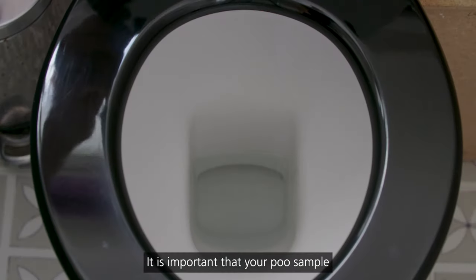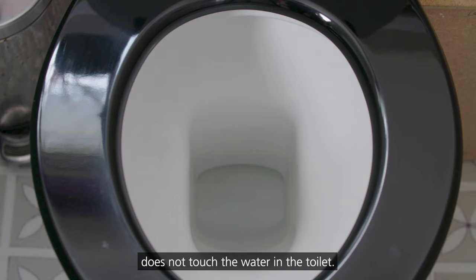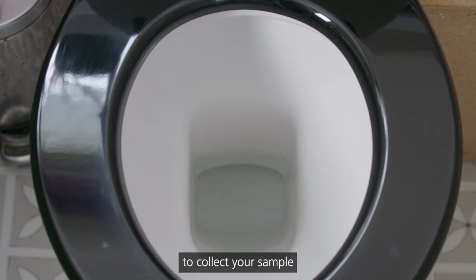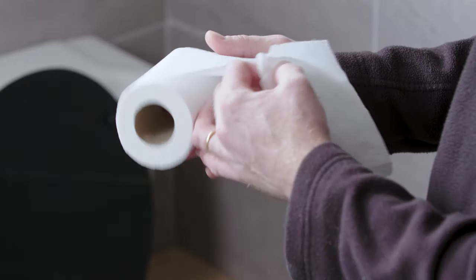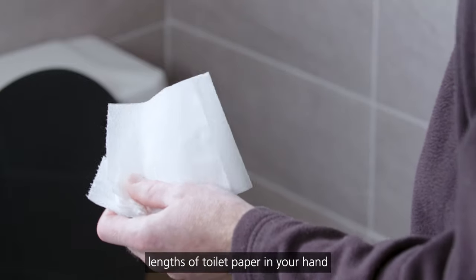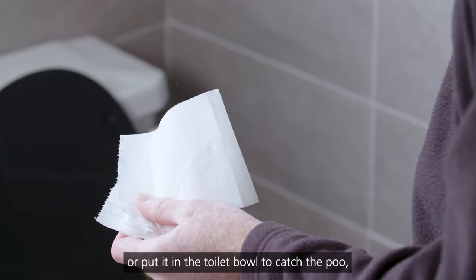It is important that your poo sample does not touch the water in the toilet. There are different ways to collect your sample and you may find a way that is easier for you. You could hold a folded length of toilet paper in your hand, or put it in the toilet bowl to catch the poo.